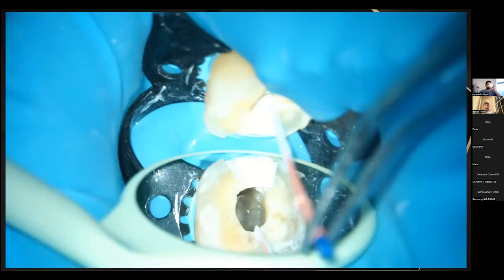But also, the thicker the sealer you use, the more difficult it is to get it to length too. Yes. So if you compare that to a bioceramic sealer, I only noticed the other day that I haven't really even coated this cone all the way. So you'll see in the mirror just down here, there is still some GP showing. So it's not like I've cheated and I've got a ton of sealer.